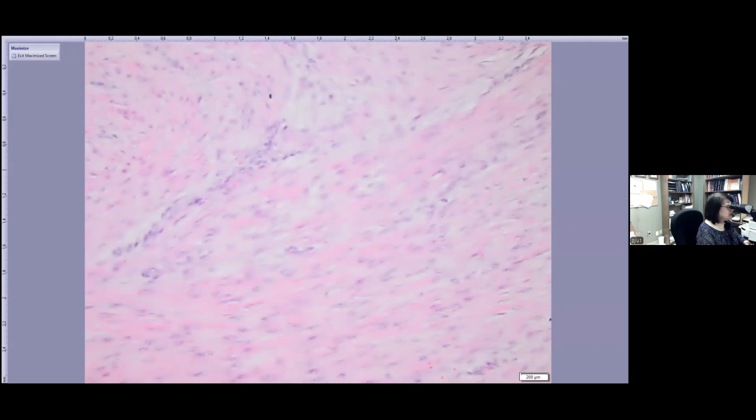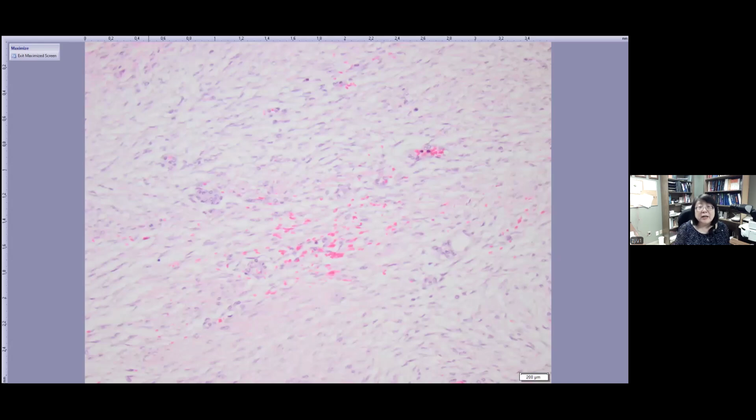And look around, you can see some area, a little bit myxoid change, with some red blood cell extravasation. Red blood cell extravasation, hemorrhage, a little myxoid area. So in the young infant, in the scalp, myofibroblastic proliferation, there are of course always a big list of differential, but in this category, there's one lesion that definitely comes into the differential.